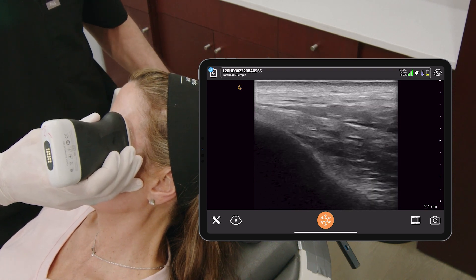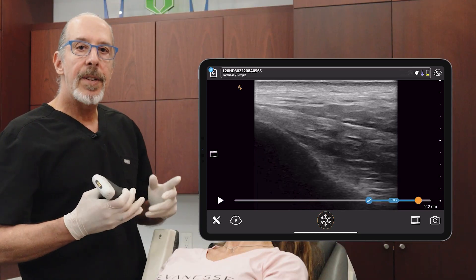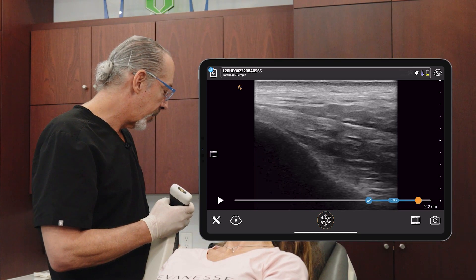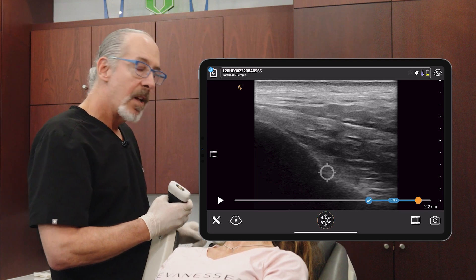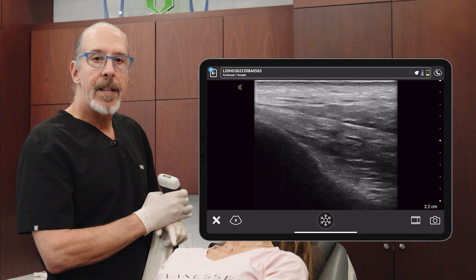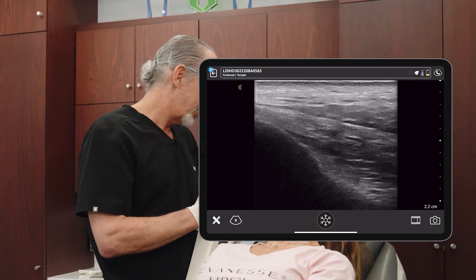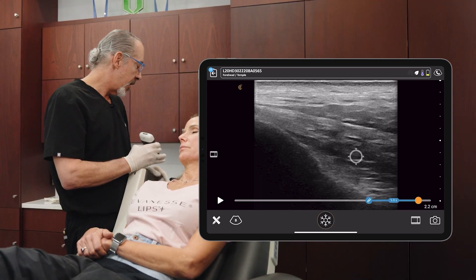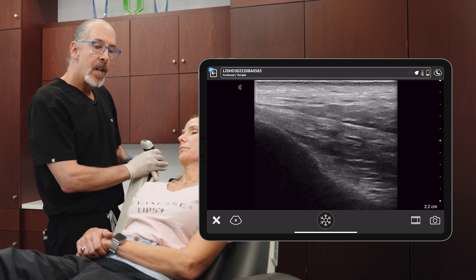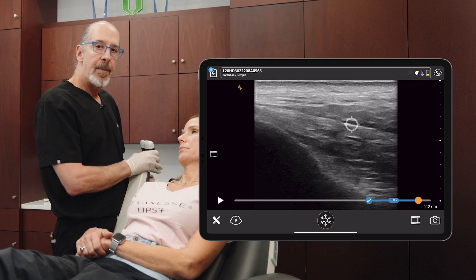Let's go through the anatomy here. The very deepest aspect is your bone. The next layer is going to be your temporalis. Keep in mind that there is no periosteum on the temple bone. This here is the temporalis muscle. The next layer is going to be your deep layer of your deep temporal fascia.